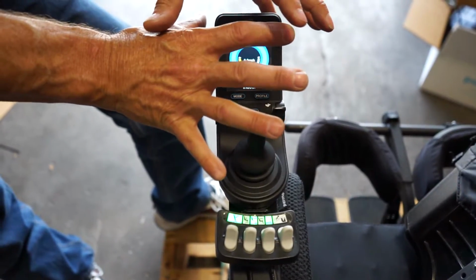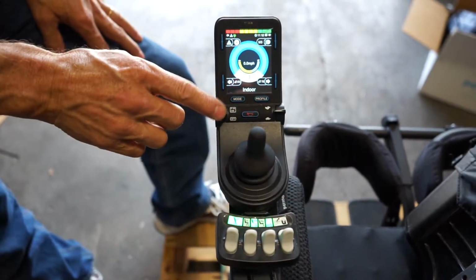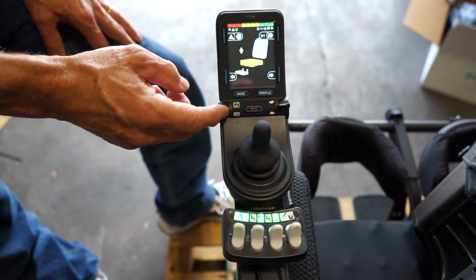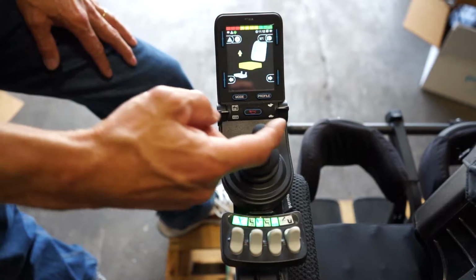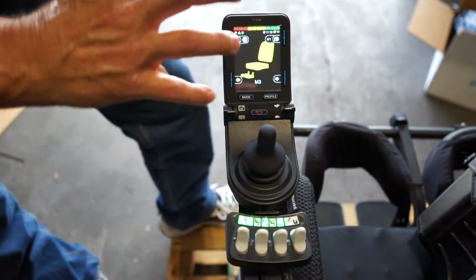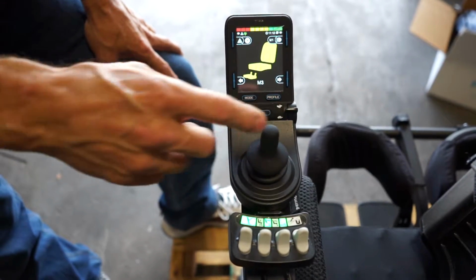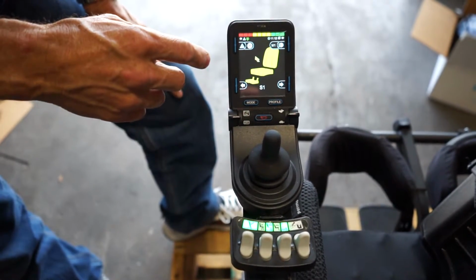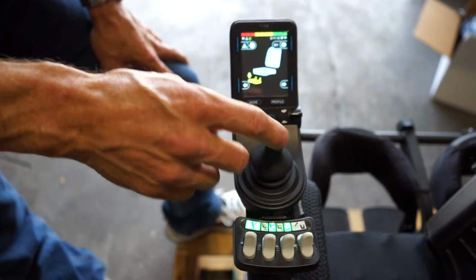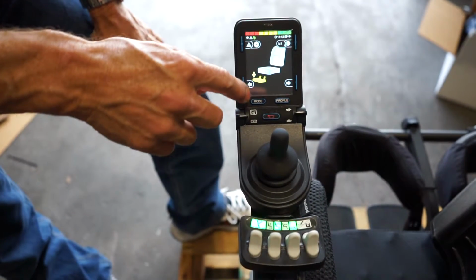If you're going to work everything through the joystick instead of using this, you have to keep pushing this button forward until you see a picture of the seat. So if you go forward, when you see this picture, whenever you move this, like right now everything is yellow, that would be the complete tilt of the chair, okay? If I keep moving, now that would be the seat elevation. If I keep moving, that's just the feet going up and down right here, okay?